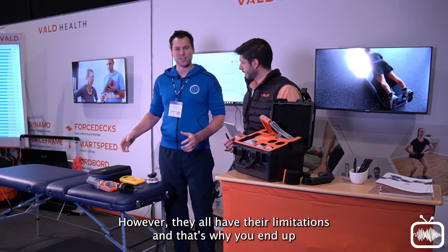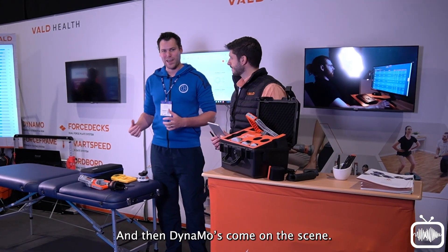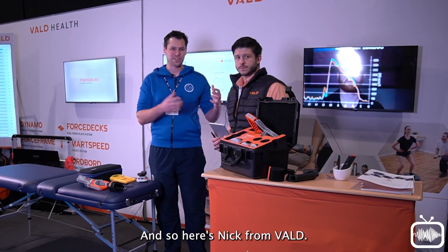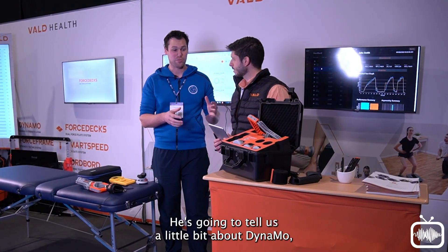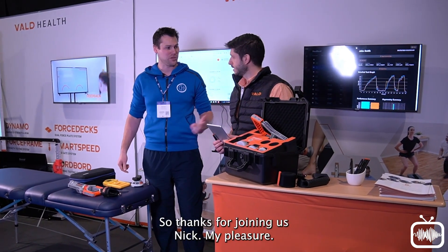However, they all have their limitations, and that's why you end up with three of them — because really you kind of need to pull as well, and that's where Dynamo comes onto the scene. Here's Nick from VALD, who's going to tell us a little bit about Dynamo and then put it to the test, comparing and contrasting some of the tech that we already use.